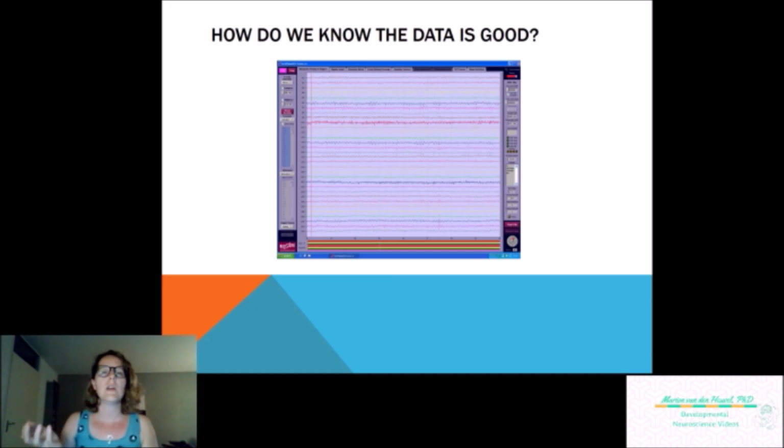So you always have to look at, okay, this baby can take a little bit more fidgeting with gel and electrodes, and then I can achieve a little bit better data. But you really have to be careful and keep an eye on the baby and how much the baby can take. So it's really important to know what data is fixable offline, because there are a lot of tricks that can help you to achieve better data. There's filtering, there's some artifact rejection that you can use, and it's good to know that sometimes data can look a lot better after pre-processing.